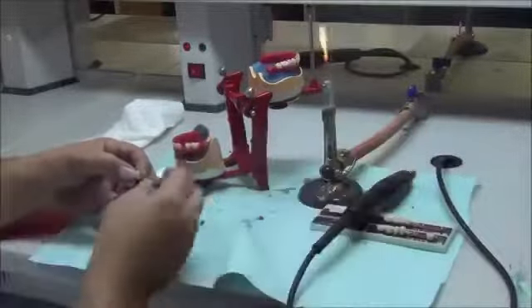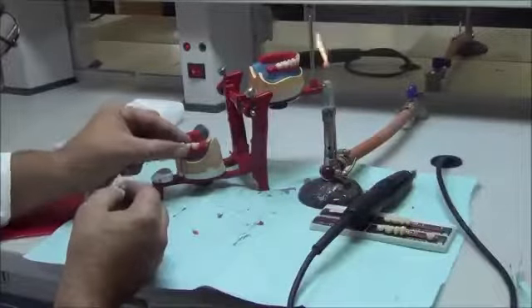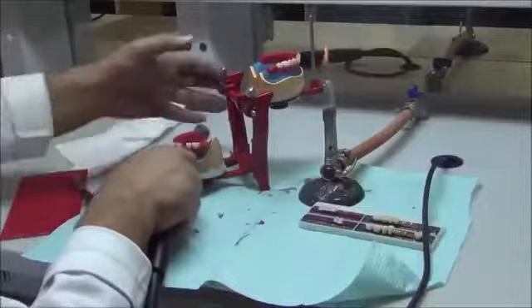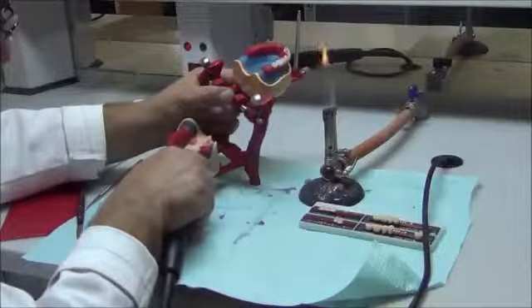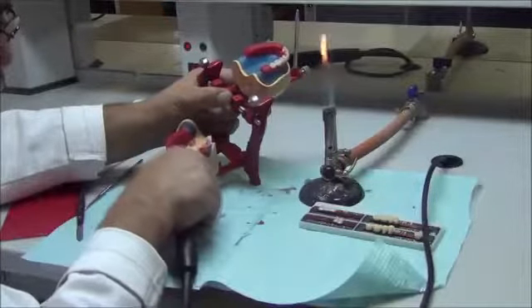If I find that the occlusal table will be ruined and the tooth becomes abnormal in shape, we can also remove from tooth number 5 as well. So now we could also remove from tooth number 5 mesially. And this will also give us extra space.